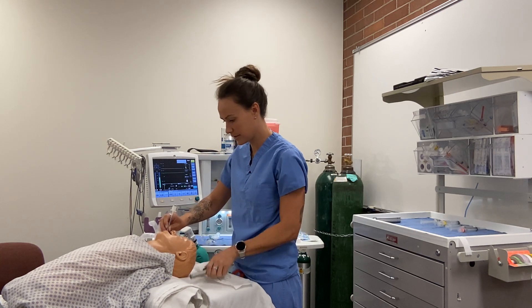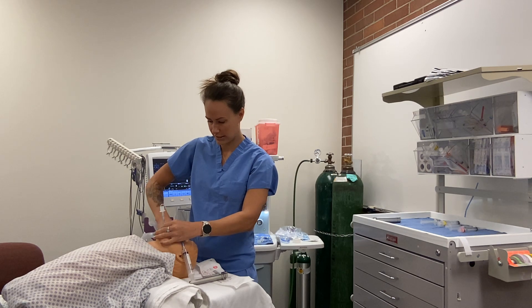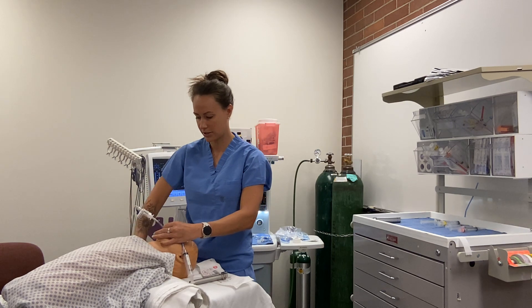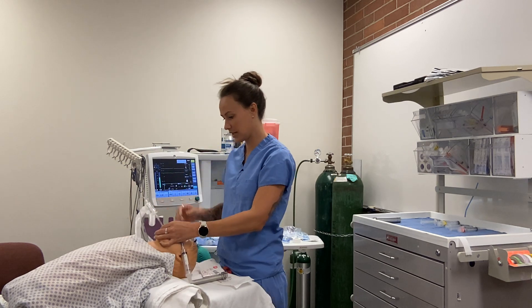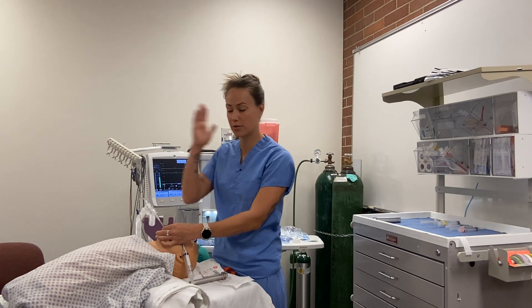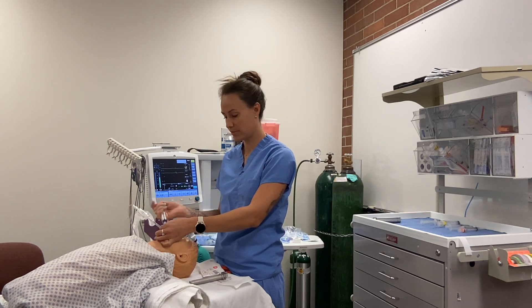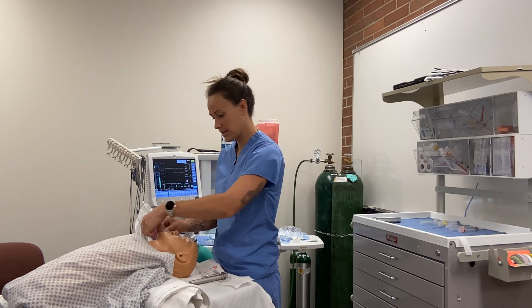We're in good position. Now I make sure the tube is in the right place. I push on the child's chest and look for misting in the tube. I give a breath, observe chest rise, then use my stethoscope to listen bilaterally at the axillary lines and over the epigastric area. Everything sounds good. If you have a cuffed tube, inflate the cuff and tape it securely to the face.